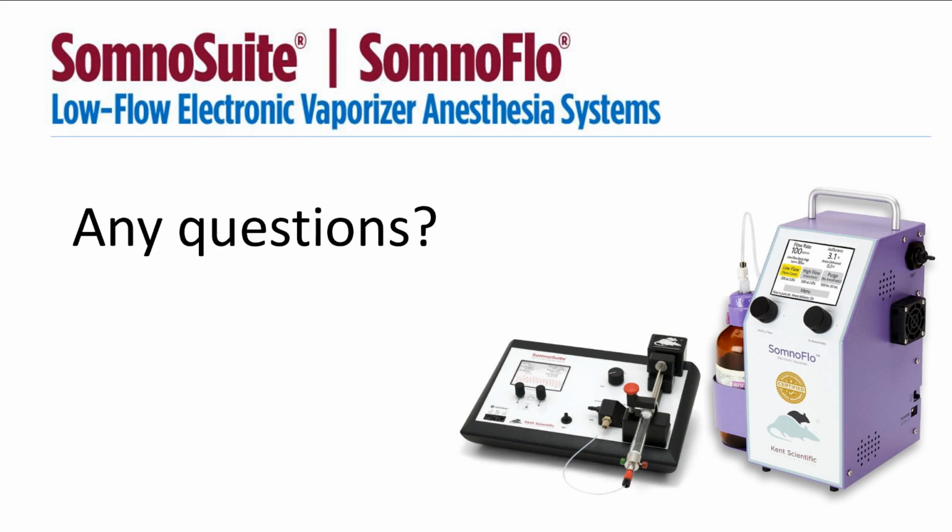Yes. So when you purchase a SomnoFlow, we supply all the basic tubings you need to get started right away. We also sell a starter kit, which comes with an induction chamber and an additional 3 accessory connector. And in terms of connecting to a stereotaxic system, we do have adapters that we provide you when you purchase the SomnoFlow system as well.